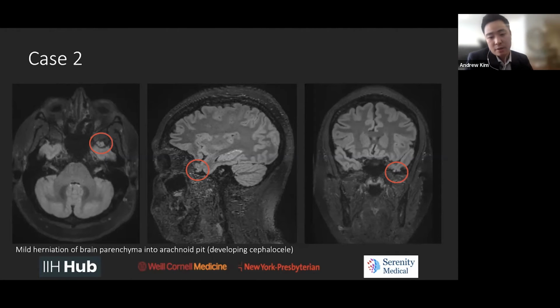And in this case, specifically a developing encephalocele, which by definition means some of the brain parenchyma is also herniating through. And it's in these kinds of cases where, rarely, you can run into clinical scenarios where a patient with IIH can actually present with seizures. Any situation where brain is abnormally protruding through any kind of foramina, any kind of prominent space, you can imagine that a seizure is always within the realm of possibility. It wasn't in this patient, and it's very uncommon, but it is something that you can see as a presentation in a patient with IIH.